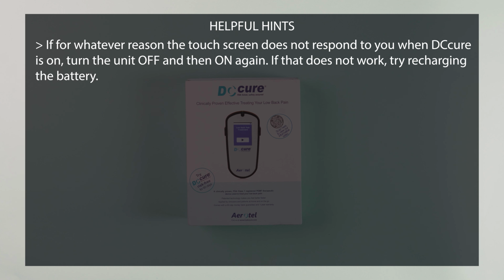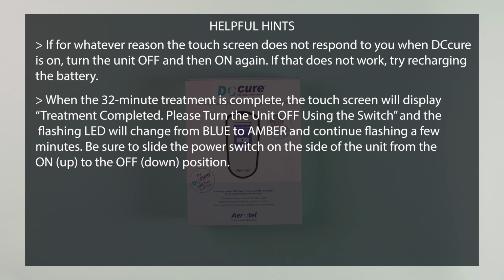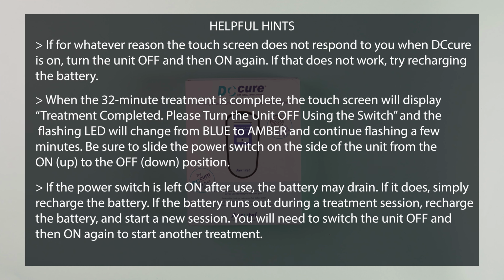If, for whatever reason, the touchscreen does not respond to you when DC Cure is on, turn the unit off and then on again. If that does not work, try recharging the battery. When the 32-minute treatment is complete, the touchscreen will display "Treatment completed. Please turn the unit off using the switch," and the flashing LED will change from blue to amber and continue flashing a few minutes. Be sure to slide the power switch on the side of the unit from the on to the off position. If the power switch is left on after use, the battery may drain. If it does, simply recharge the battery.